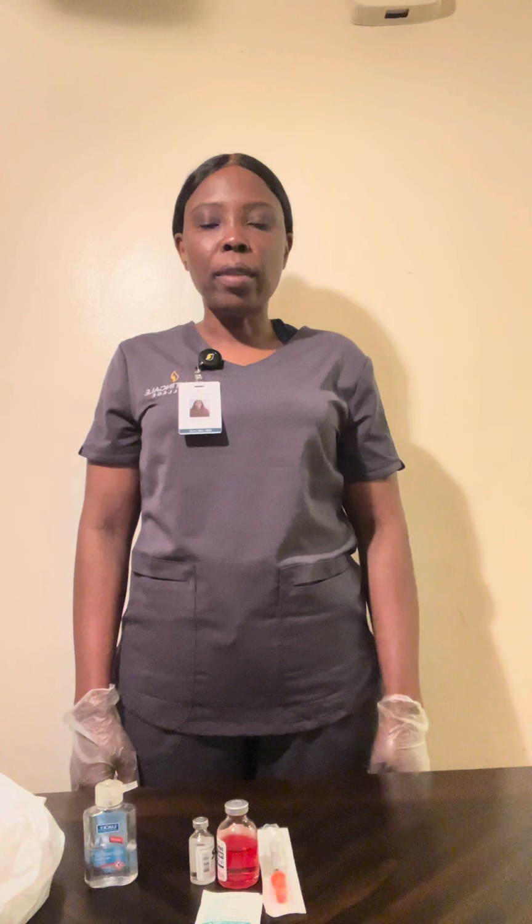Okay, Mr. Smith, now I will have a fellow nurse come to verify those calculations for me. Today the doctor has ordered 4 units of regular insulin and 8 units of NPH. That gives me a total of 12 units.